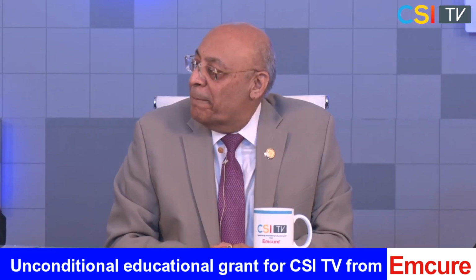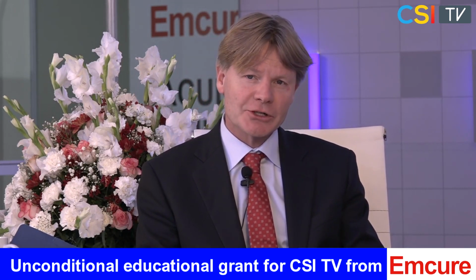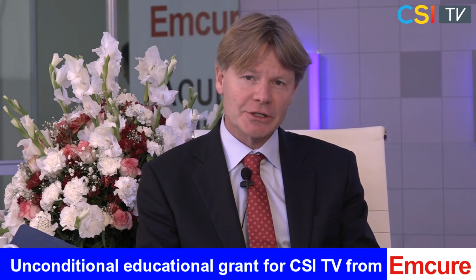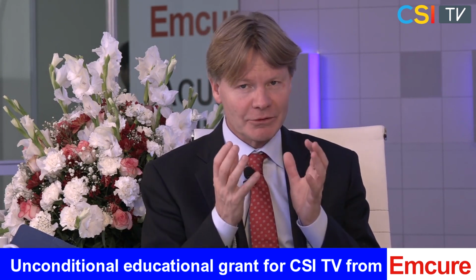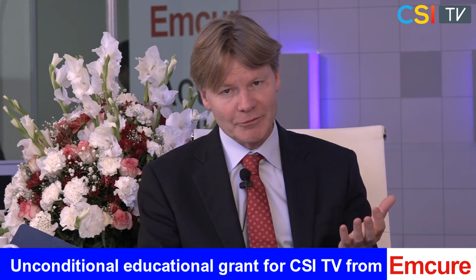Dr. Jeroen: Well, thank you very much. It's a pleasure to be here, and I think strain has become very useful for us. We are used to measuring left ventricular performance by looking at ejection fraction. And ejection fraction, if you carefully analyze it, is basically nothing different than the volume of blood that's in the ventricle and the volume of blood that's leaving the ventricle during systole.